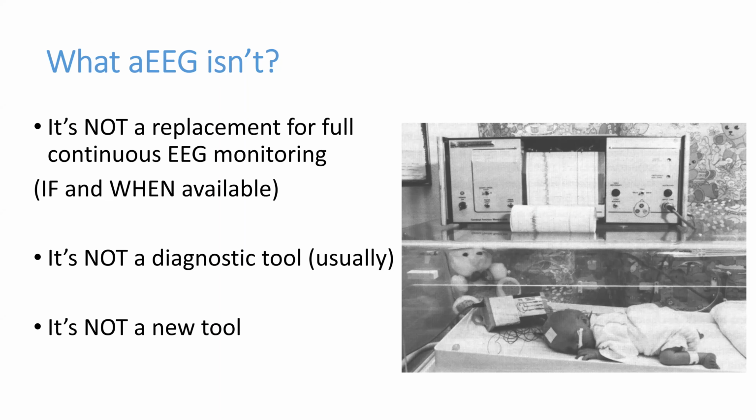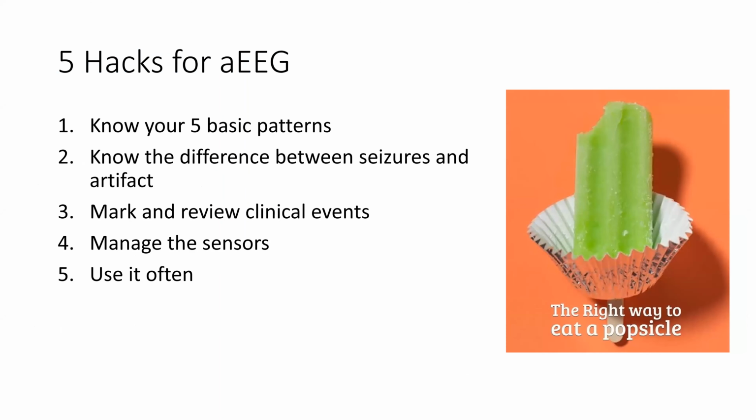And so let's now dig into what I'm calling the 5 hacks for you, because I want to make sure that you feel comfortable using aEEG. So even if you don't think that the hacks are that helpful, I hope that you'll appreciate that I Googled and found a zillion different fun little hacks. And I've actually given you some life hacks along with your aEEG hacks, just in case you're not digging the aEEG one. So first off, we're going to talk about the patterns.